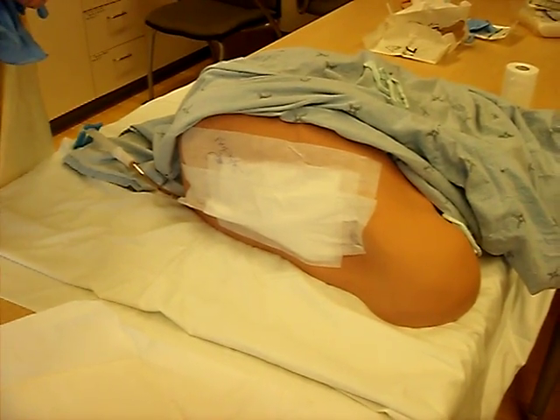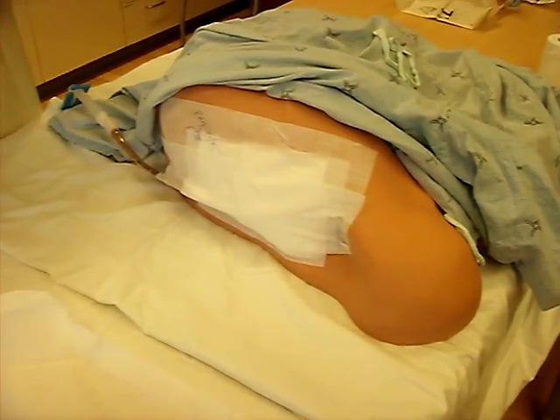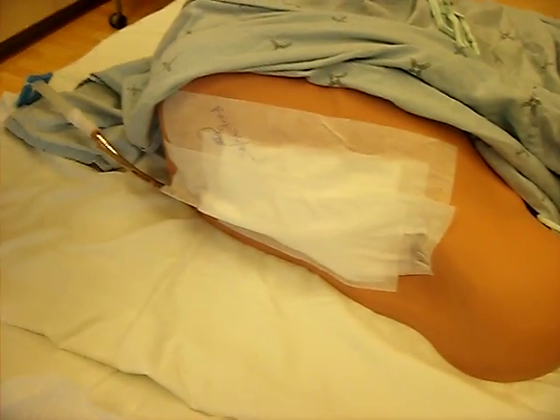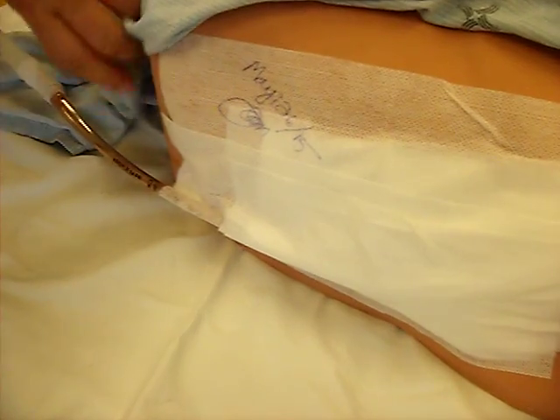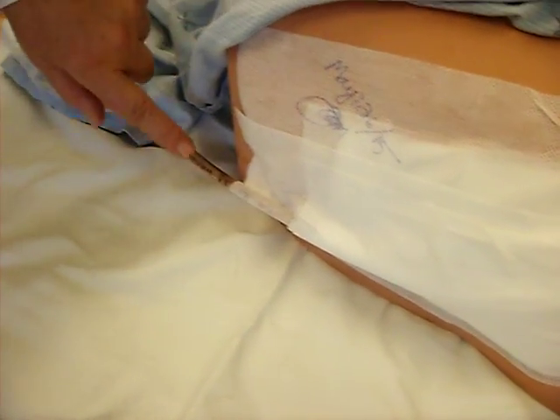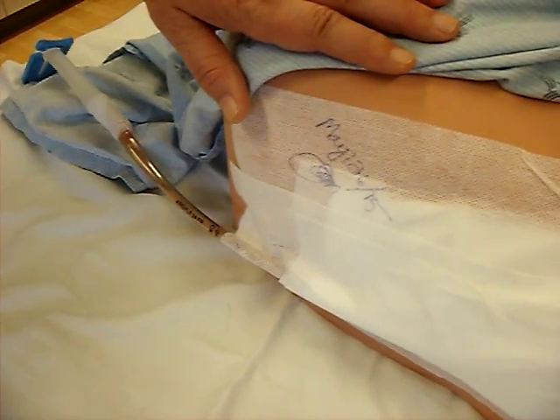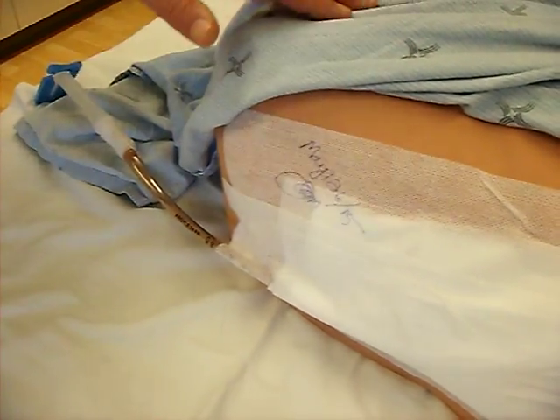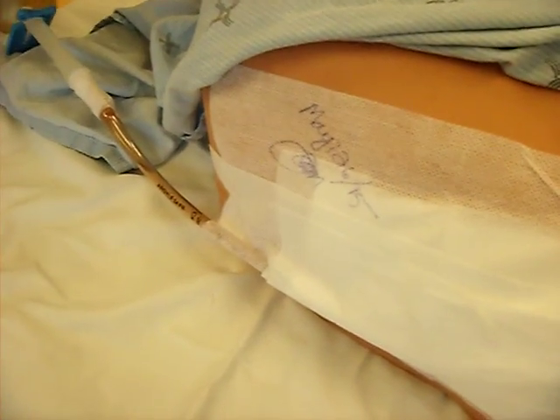You must have a doctor's order in place to be able to remove a chest tube. You can't do it on your own volition. And you have to make sure that the reason the chest tube was put in is now resolved, and that usually means a decrease in the drainage coming out of the tube. Usually there's some sort of confirmation by a series of x-rays taken while the chest tube is in situ that shows a gradual resolution of the fluid in the chest.